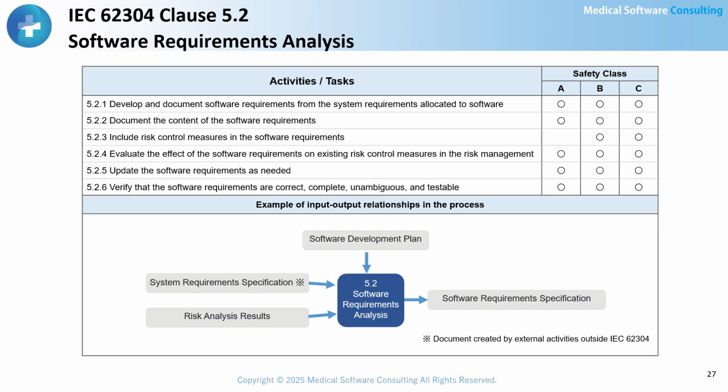The content of the software requirements may include functional and performance requirements, inputs and outputs of the software system, interfaces between the software and other systems, alarms, warnings and messages displayed to the operator, security requirements, user interface requirements, data definitions and database requirements, requirements for software installation and acceptance, IT network-related requirements, user maintenance requirements, and also regulatory requirements. Once the software requirements are defined, the role of the software within the medical device becomes clear.